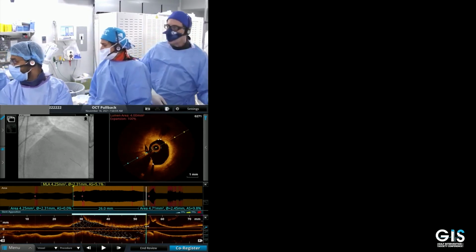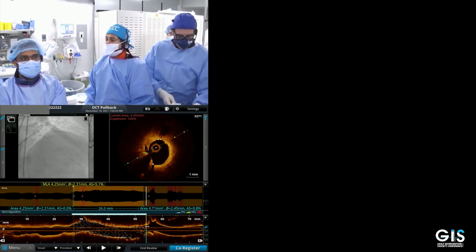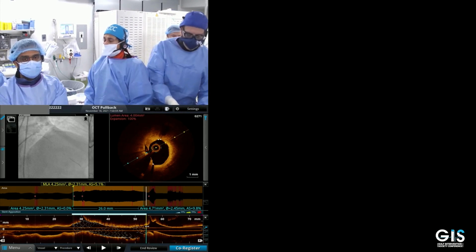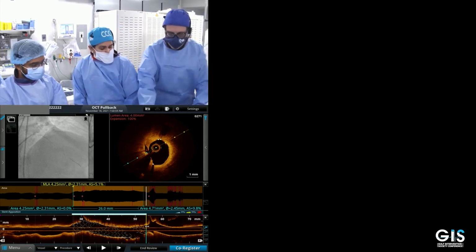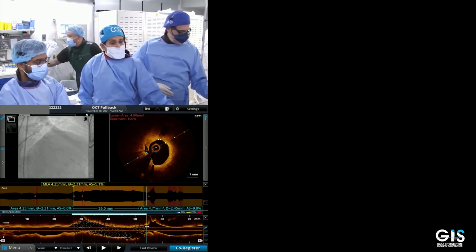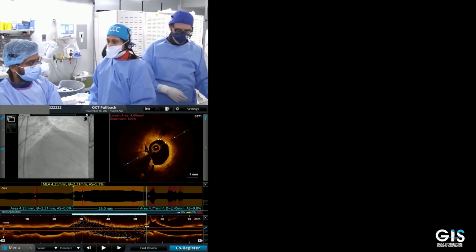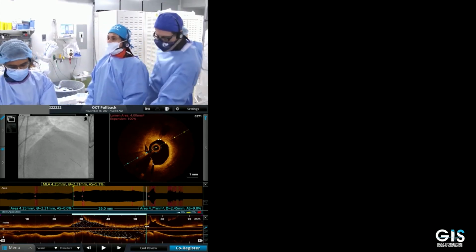Okay, we have a comment. Go ahead. I think OCT is so good that a lot of people just react to anything. And this is the time that you should not react to everything. So I totally agree that this is benign and we should not proceed. A lot of the time we see dissection, you don't have to react. Because we do imaging, we will see more. And part of it is to know when to stop. That was the criteria for dissection.